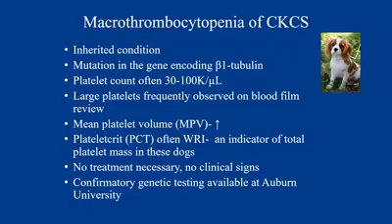There is another analyte that some analyzers give you called the plateletcrit, and that is analogous to the hematocrit. So it's a measurement of your platelet mass. And in these dogs, their plateletcrit tends to be normal, okay? There are some dogs that will have a low plateletcrit, but a lot of times they have a normal plateletcrit. And that is because these dogs, even though they have a low platelet count, they don't bleed.